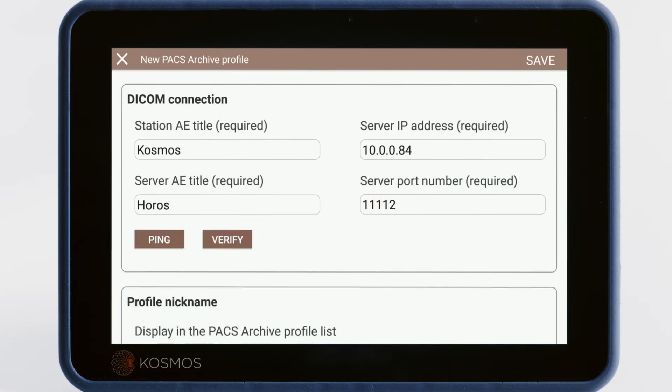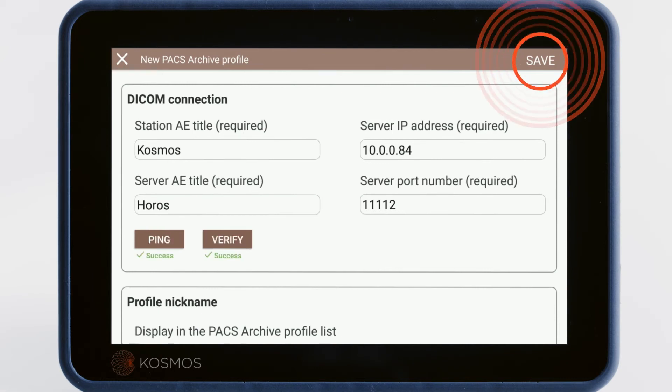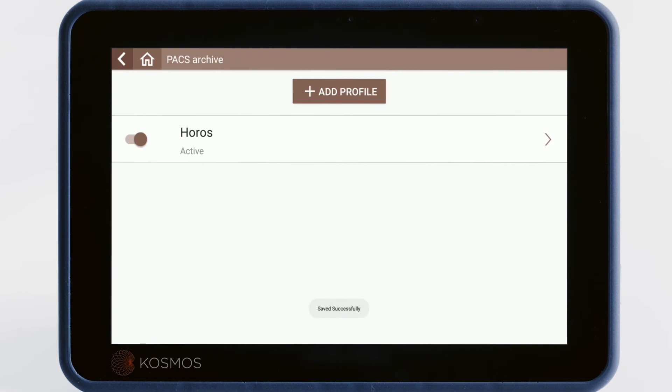Once the form is complete, tap Ping and Verify to check the connection to the server. Once you're successful, tap the Save button on the top right of the screen.